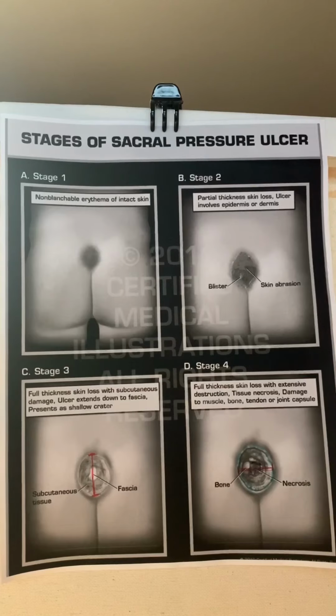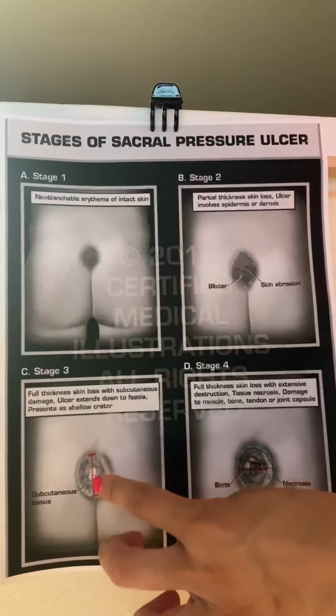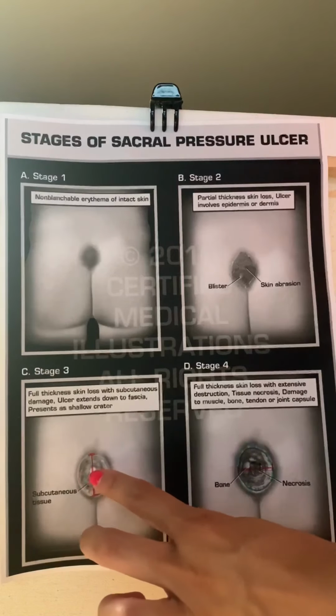So in this video, we are looking at how wound measurement accuracy impacts the safe practice of wound measurement day to day. In some facilities, wound care nurses measure their wounds by hand. They'll take a ruler and measure from the very top of the wound to the bottom, and then the ruler from that side to that side.